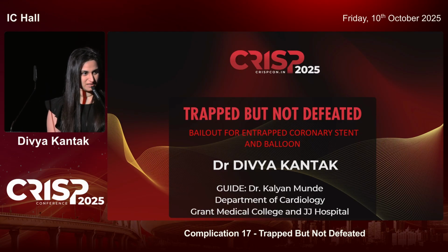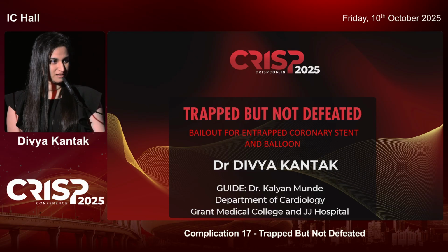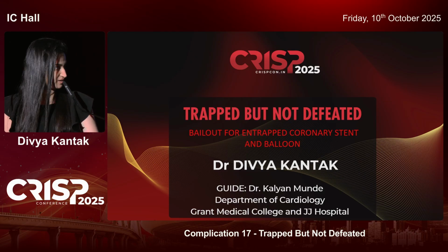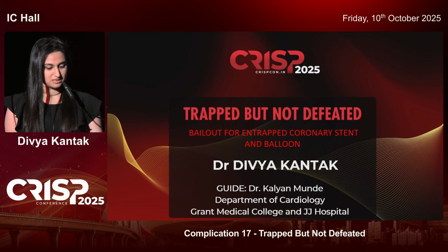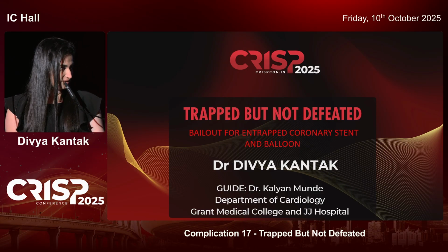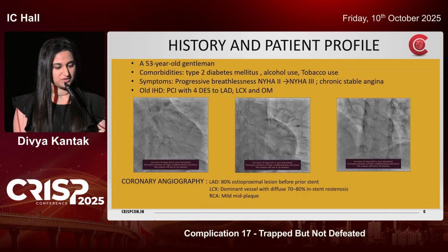Second-year cardiology resident at JJ Hospital, and today I'll be discussing a dual hardware entrapment bailout technique that we did for a complicated case. While it's not often that we see this, every interventionalist should be prepared for when it comes their way.